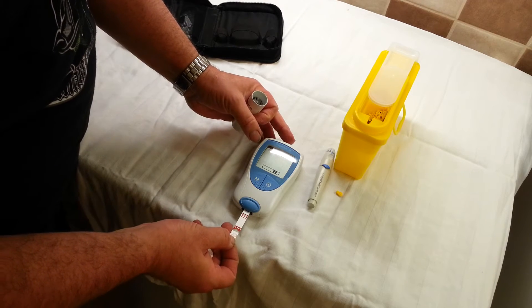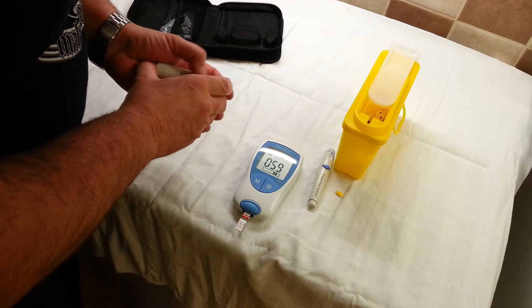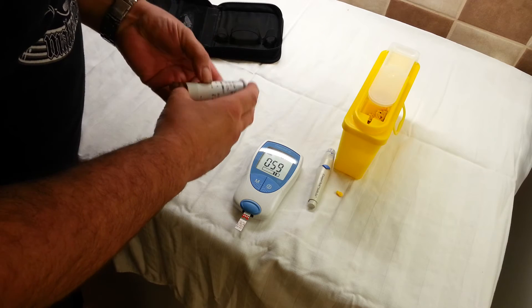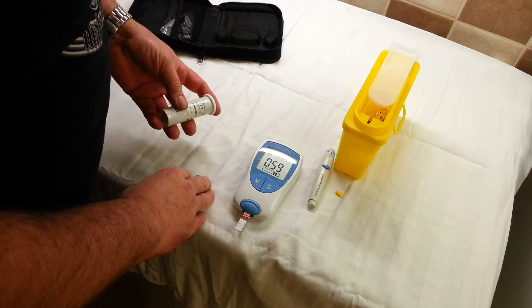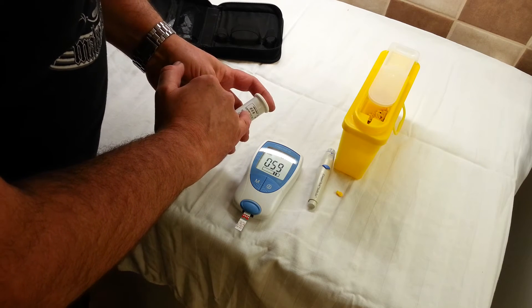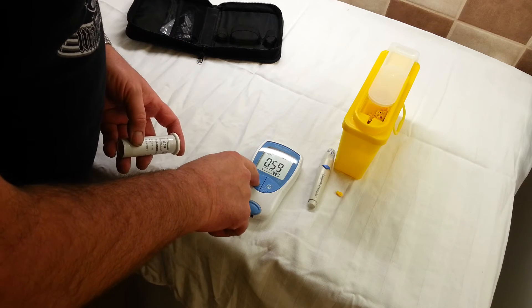The strips can be stored at room temperature and as long as the lid is not left off they will keep until the expiry date, which is usually around a year — in fact this batch goes through to October next year. It comes up 059 just to check that I have the right chip inserted, and then you press M just to confirm.